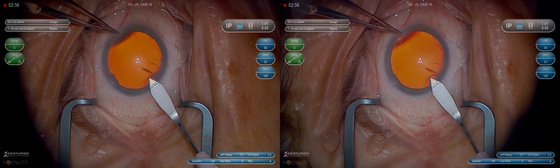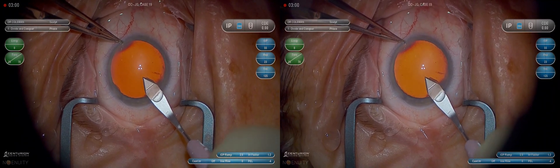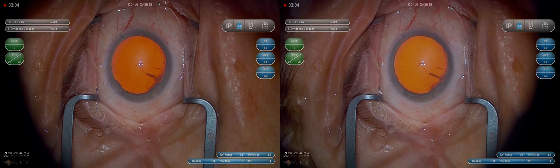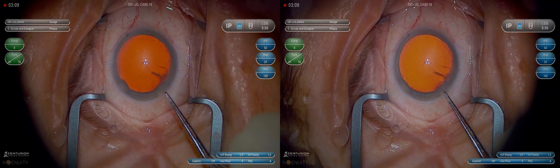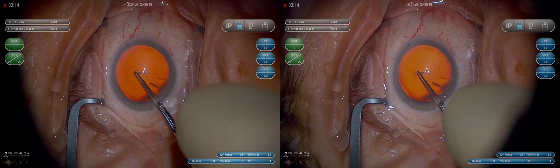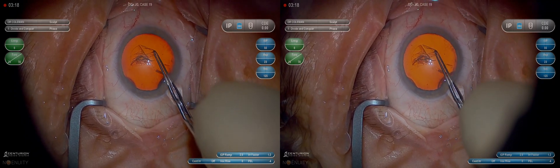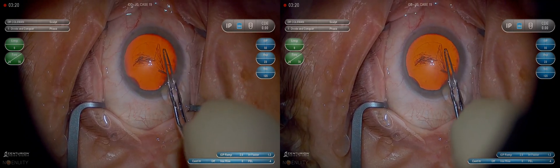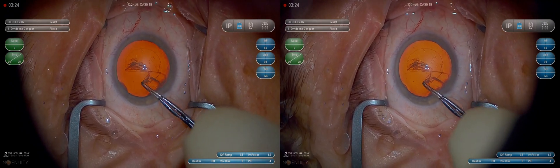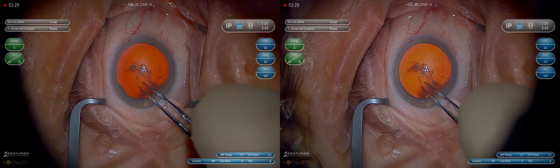I like to puncture the anterior capsule with the keratome. I think this gives me a better starting point and more control at the beginning of my capsulorrhexis. I'm going to go in with the Utrata forceps tips closed and lift up to get the rhexis going in the direction I want it, and then grasp. We like to minimize the number of regrasps — get as many clock hours as possible per grasp — because that improves your time and eliminates the risk of having trouble regrasping midway through the rhexis.